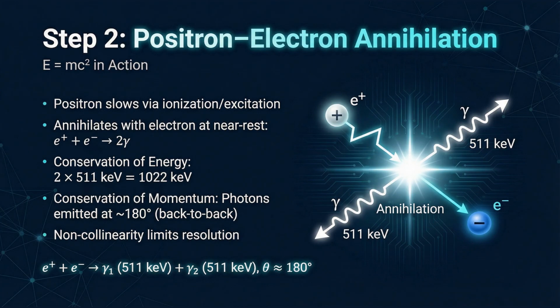The nearly is important. Tiny residual motion produces slight noncollinearity and Doppler broadening, setting a hard physics limit on resolution.